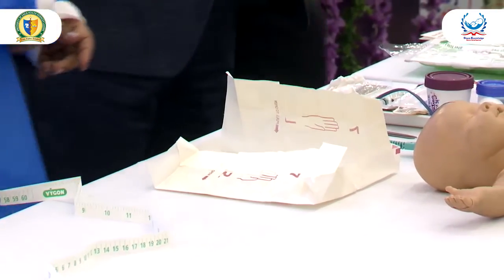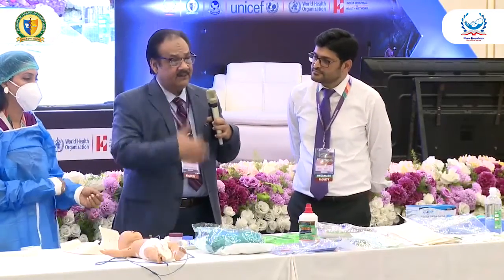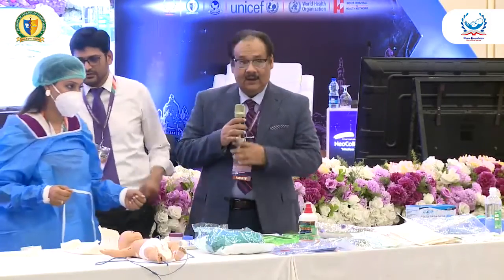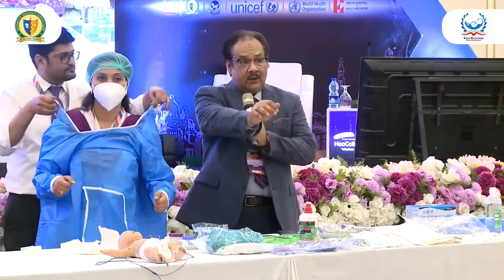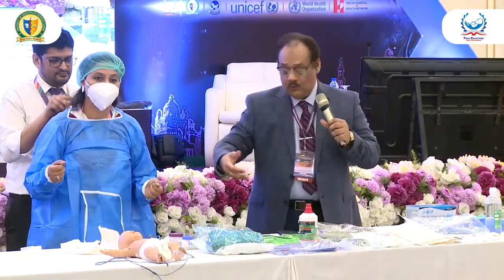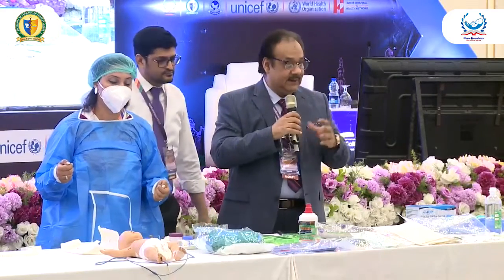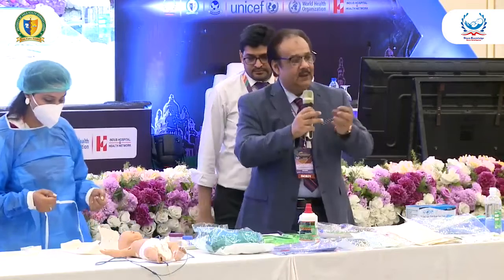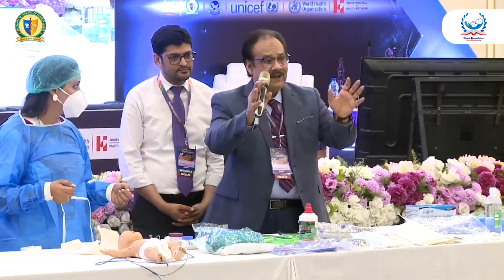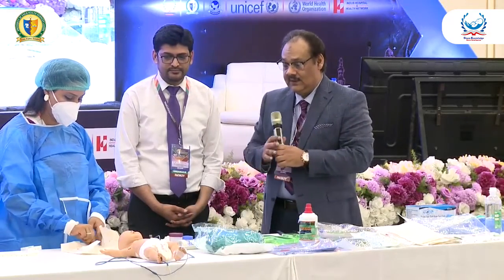Okay, so when you're putting on the gown, make sure that you do not touch the front of it. It is very important. And what our nurse did, you cannot do that, to pull your sleeves up. You should not pull the sleeves up with your hands. I have often seen this when people put on a gown, they pull their sleeves up. That's wrong. So just keep it like that, then you put the gloves. You can see how you put the gloves.